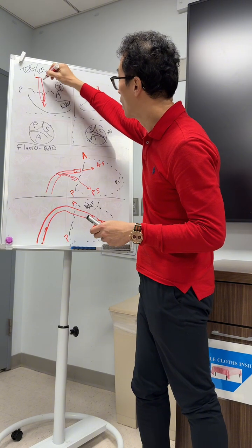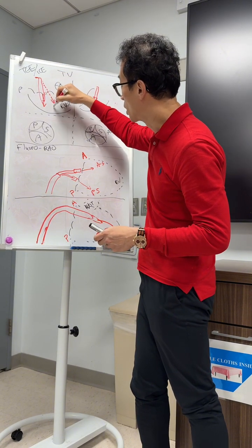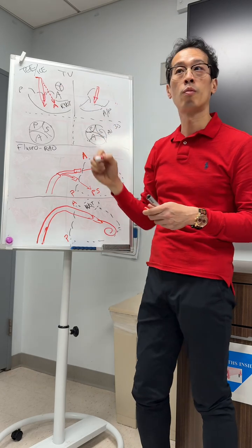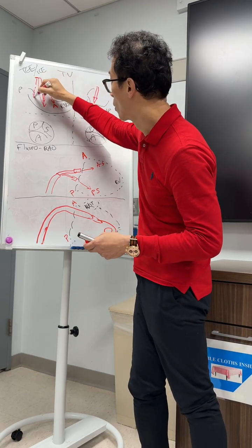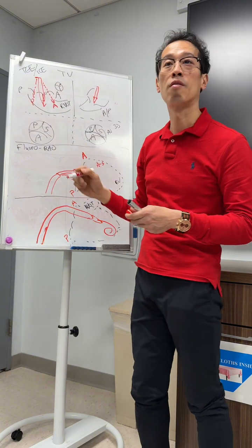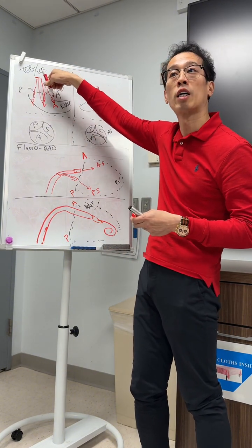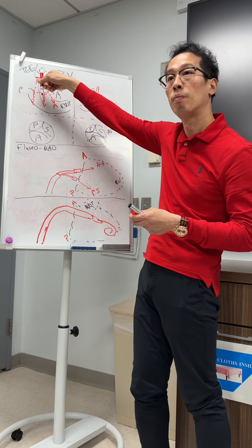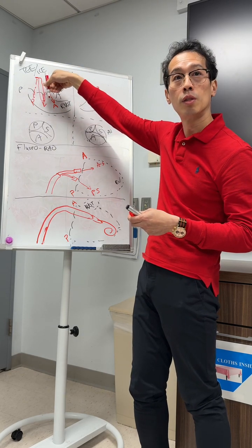Now, what if there's a situation where you're going like this? That is called anterior bias, or anterior dive. This is posterior dive. So whether it's TriClip, what do you do if it's doing this? With TriClip, you would flex more. If it's posterior dive, you would unflex.